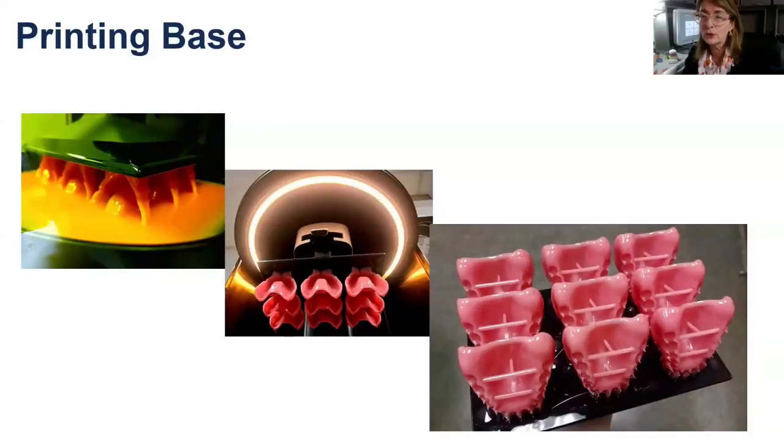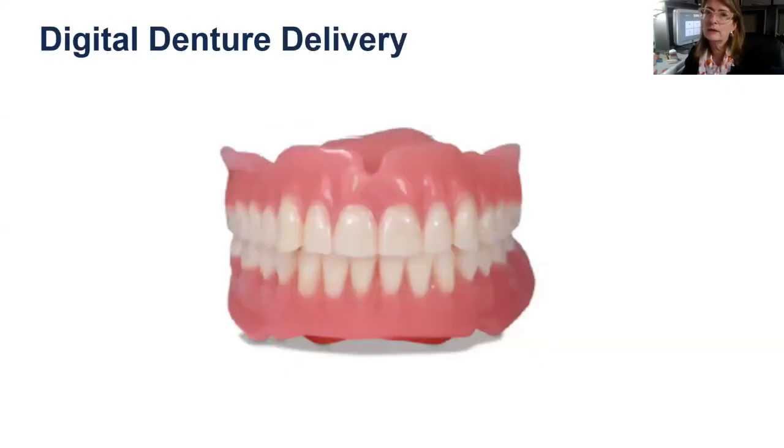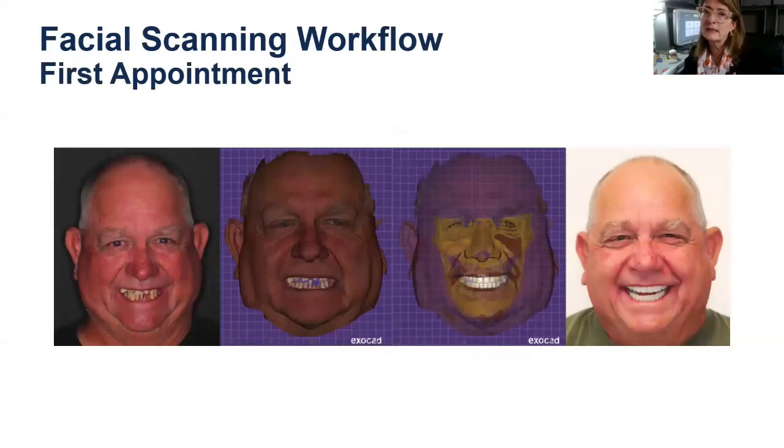It's really cool to see it happening live. And then the teeth are printed separately, but all in one piece. They're not individual teeth. And then they're luted together. So it's a chemical bond that's luting it together.